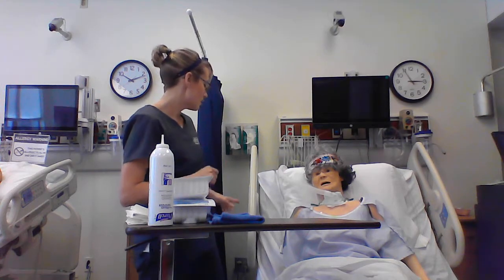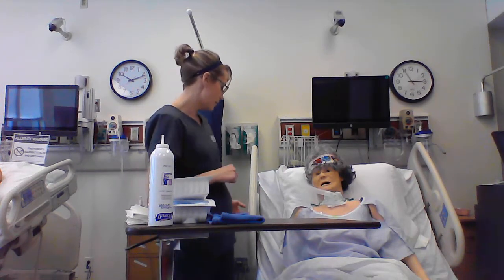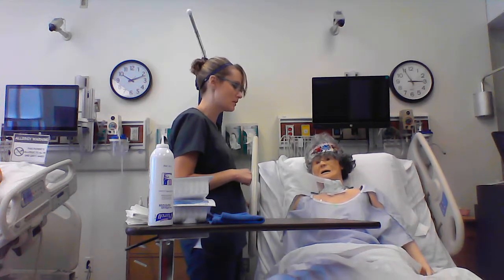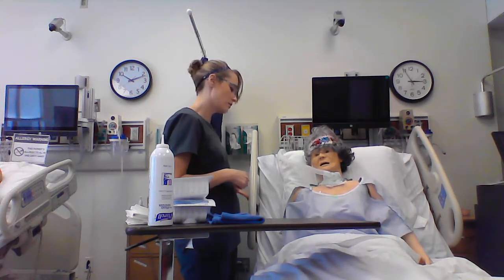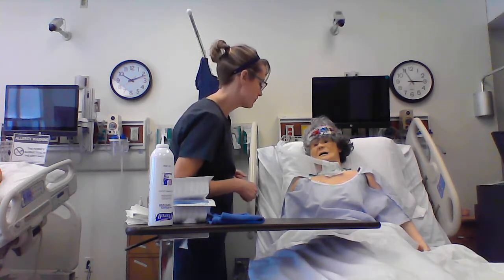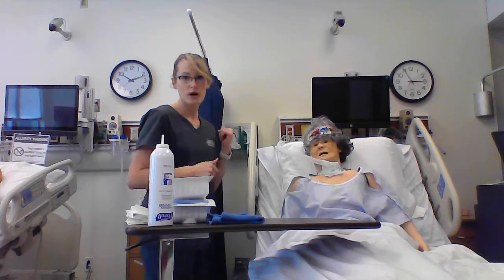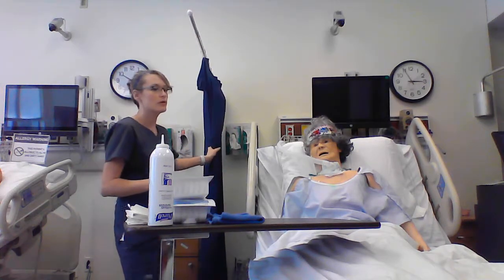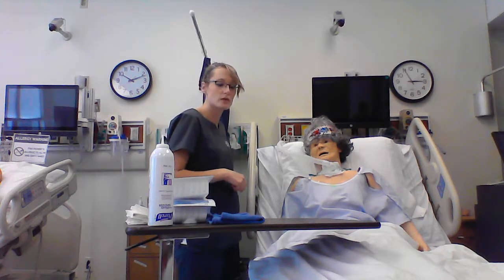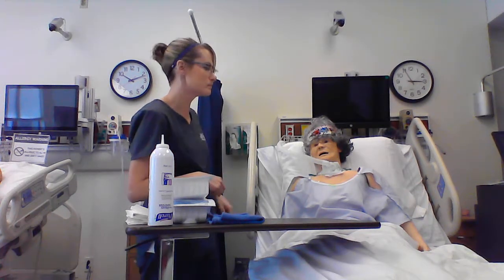She is in high Fowler's, which is where we want her to be with a tracheostomy and performing trach care, so she doesn't aspirate and to promote good lung health. I'm going to raise her bed up to a working height for me. Provide patient privacy, so I would pull this curtain behind me for her. I'm not going to because my suction and oxygen are back there. For the sake of the video, we're going to leave it open.